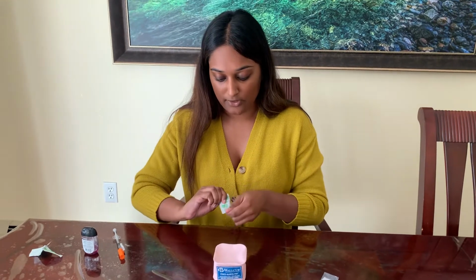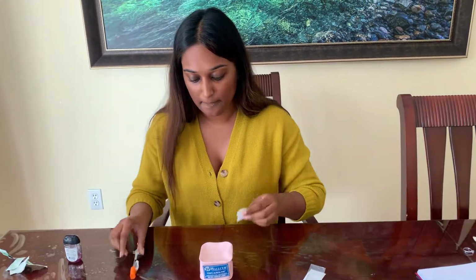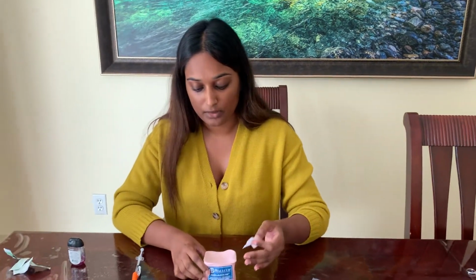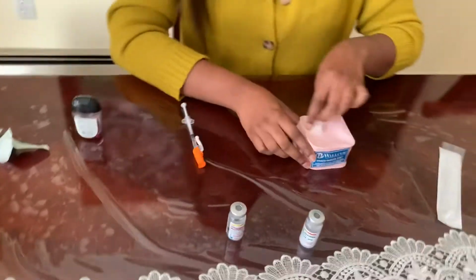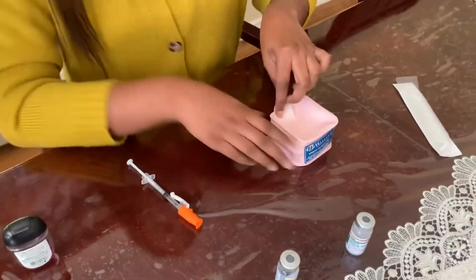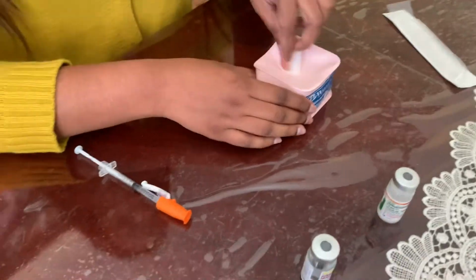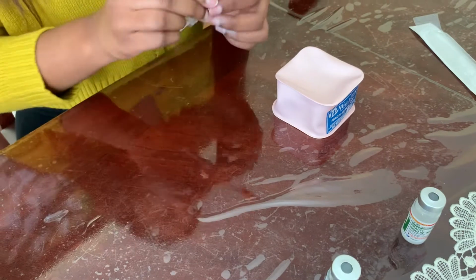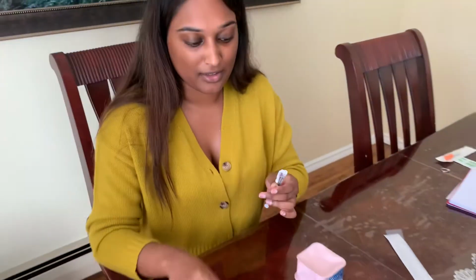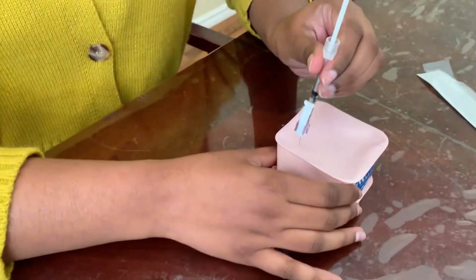Once I check that and it clears, I open my second pad that I take with me with my injection, 2 inches away from my umbilicus, making sure that each time I give the insulin I'm rotating. Wipe down, and then I'm just going to toss it over there.